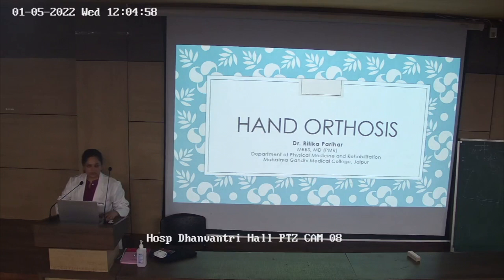See, orthosis is for support, and prosthesis is the replacement of the lost body limb or body part. Okay, so that's the basic difference. So today we are discussing only about hand orthosis.